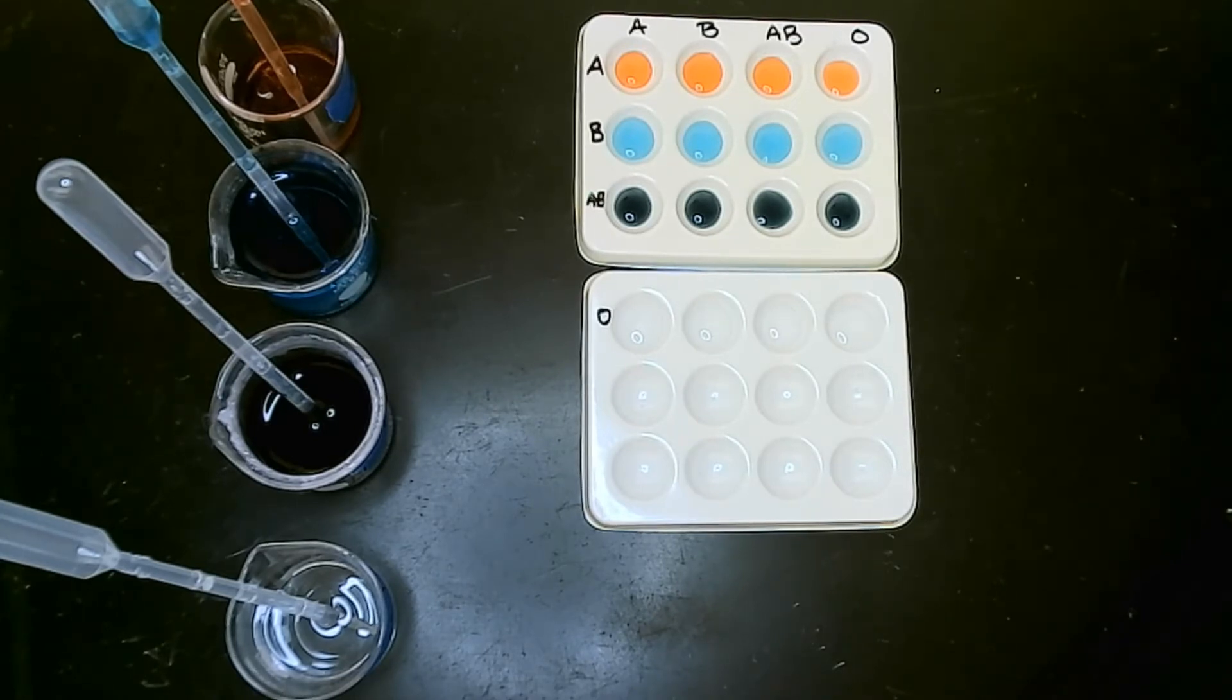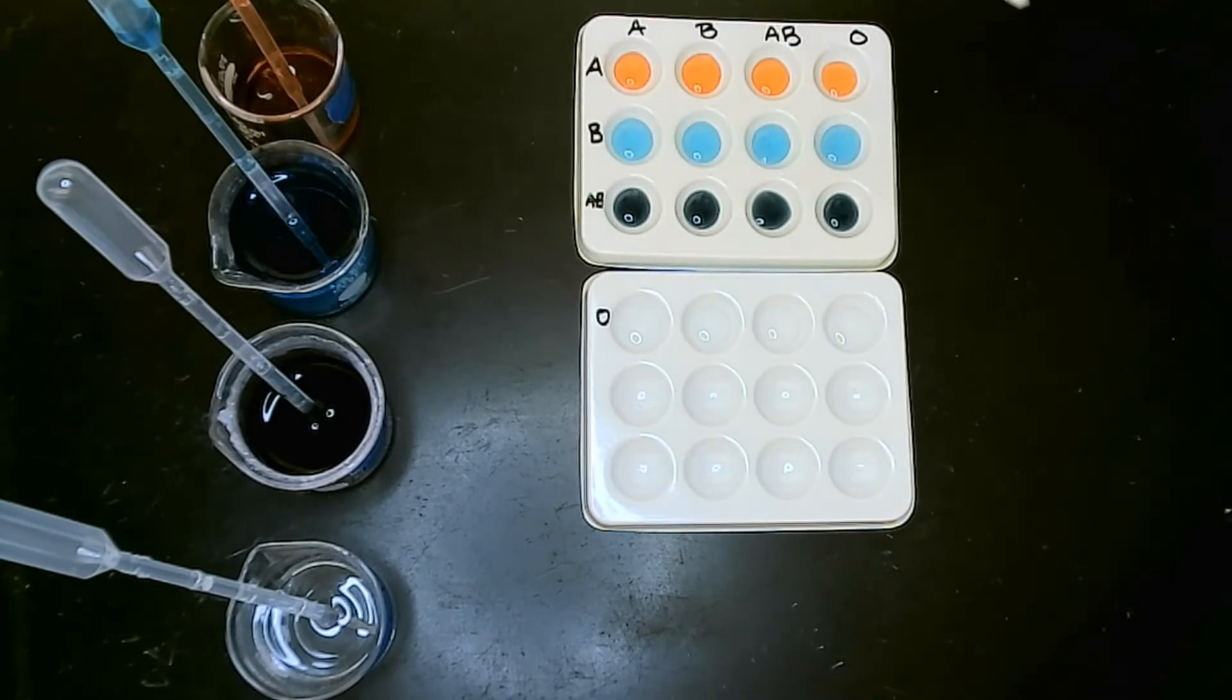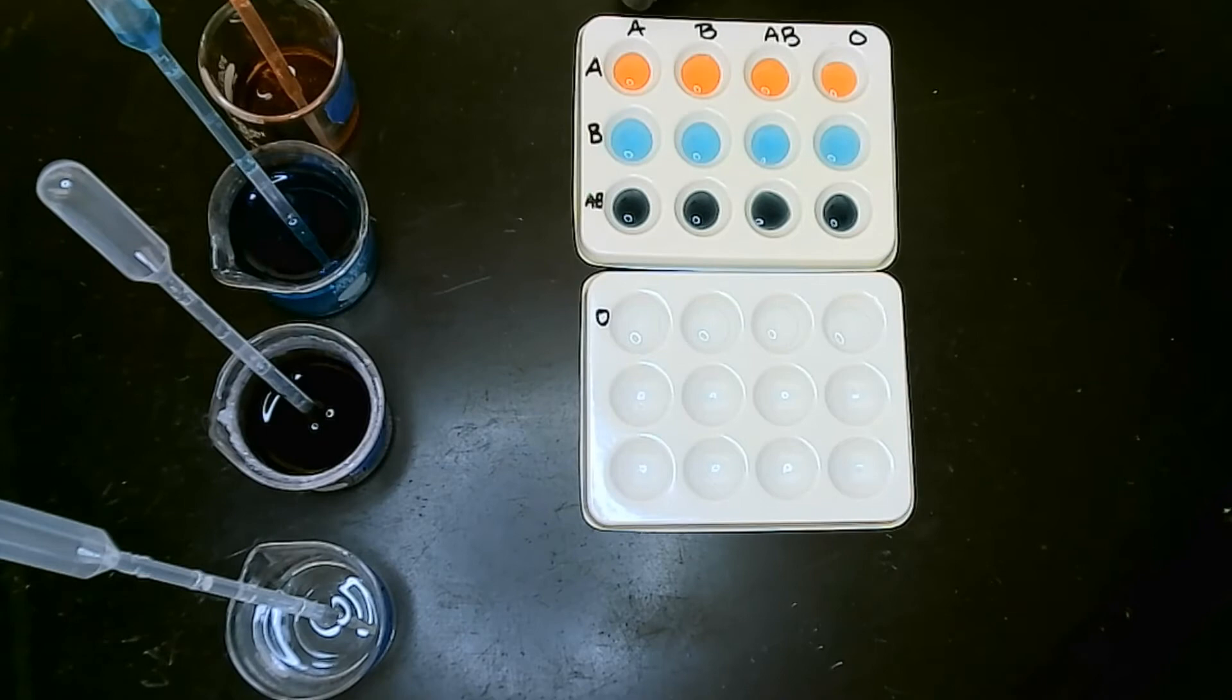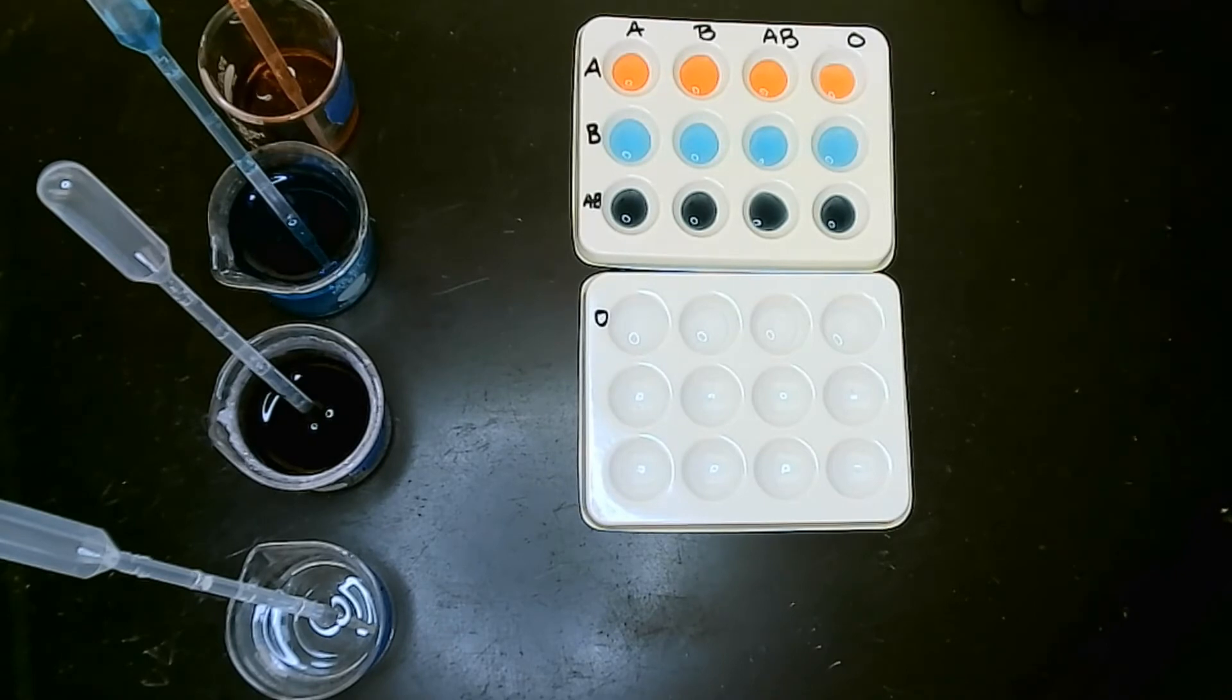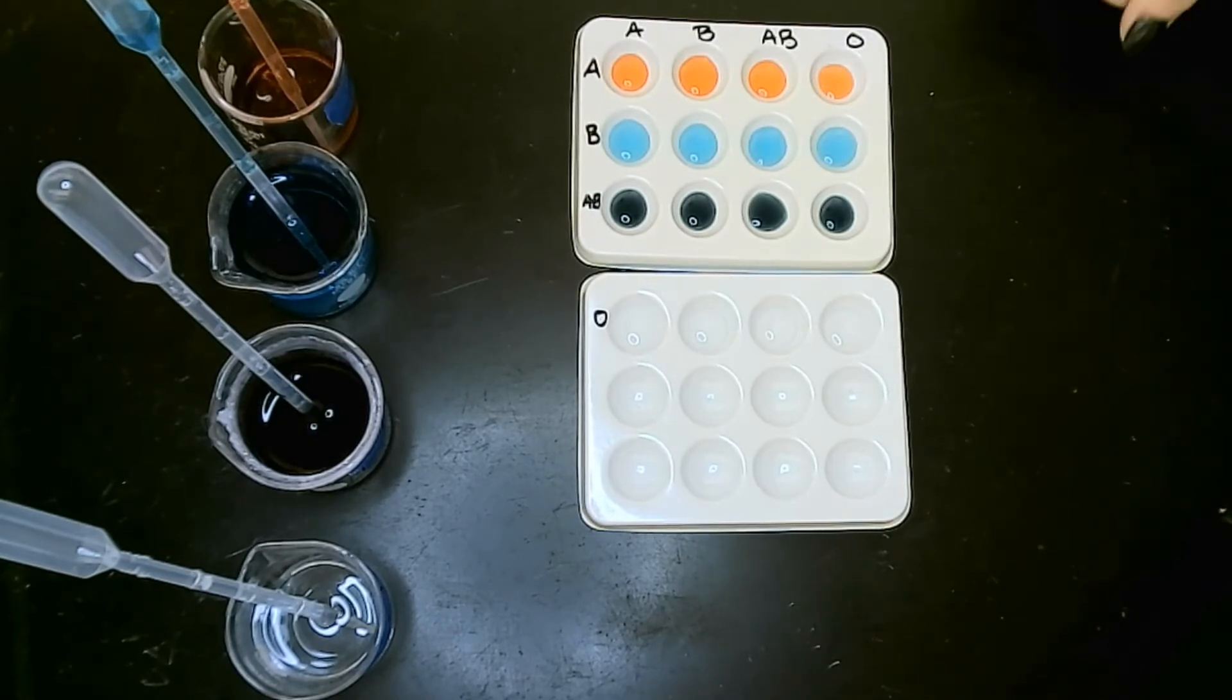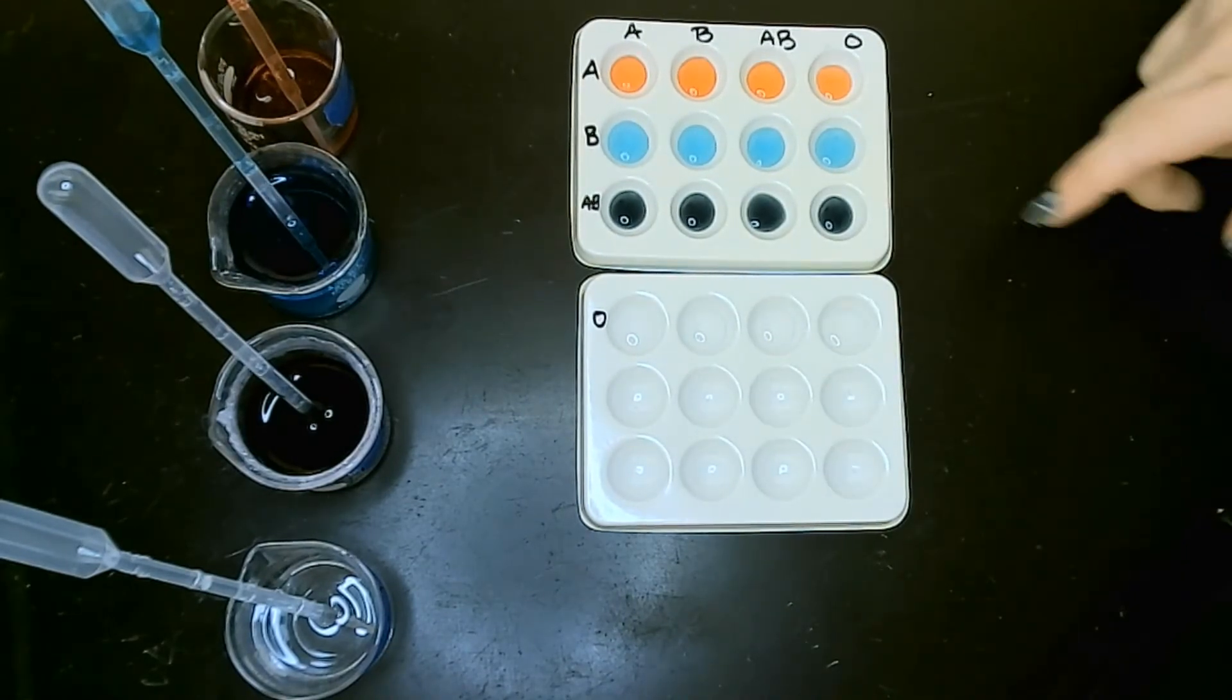So what I have here are labeled by different blood types using food coloring. The color red is representing blood type A, which I have in my first row here, and then blood type B is represented by blue. AB is a mixture of the red and the blue so it's a purple, although on the screen it looks a little bit black.